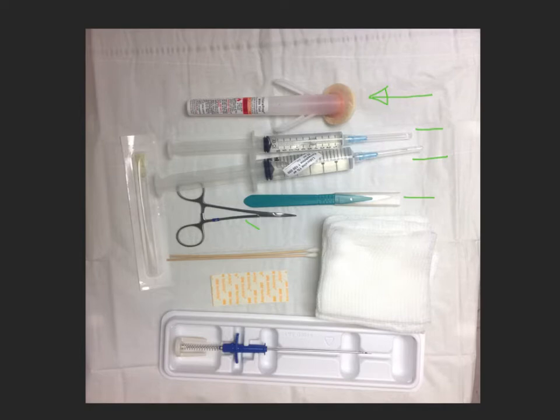Here is what we have on our prep tray. We have chlorhexidine for cleaning. We have two syringes of local anesthetic, a 10 cc without epi and a 20 cc of 1% lidocaine with epi. Our scalpel, mosquito forceps, a 20 gauge spinal needle that we use for deep anesthesia if we need it, our steri strips and some q-tips for applying the benzoin solution, gauze swabs and then we have our clip that we're going to use ready on the tray.